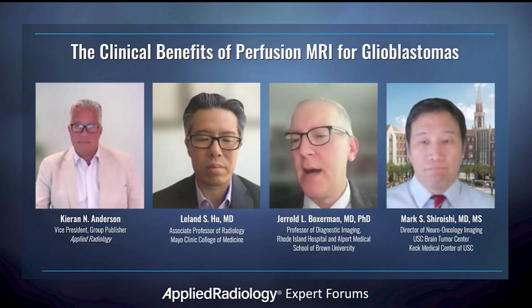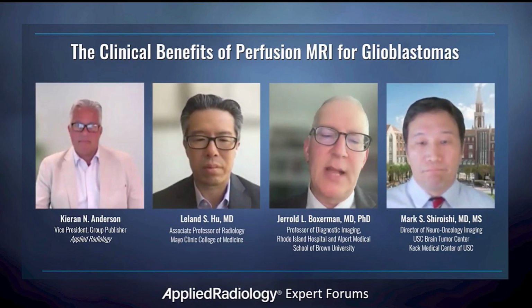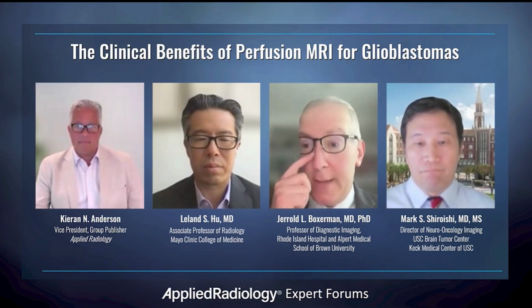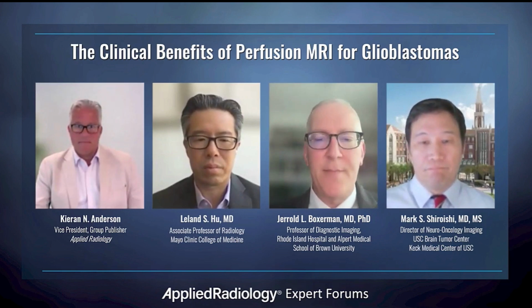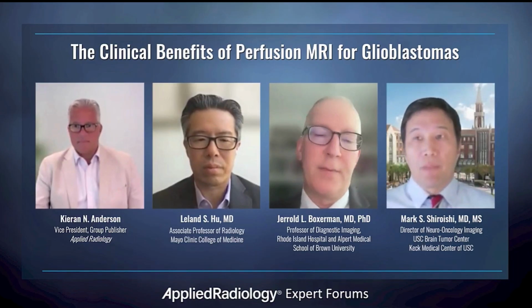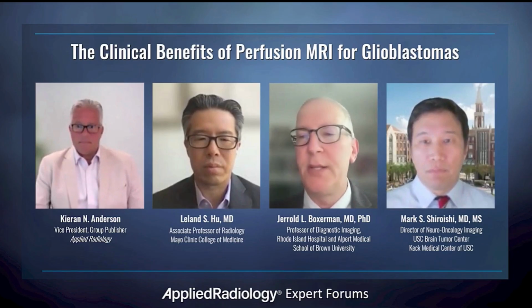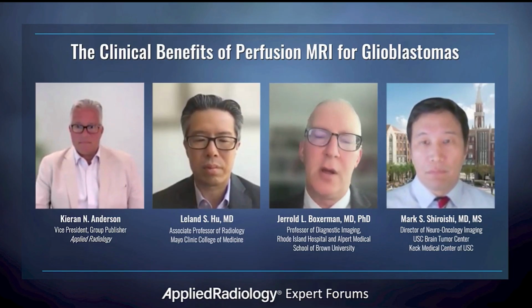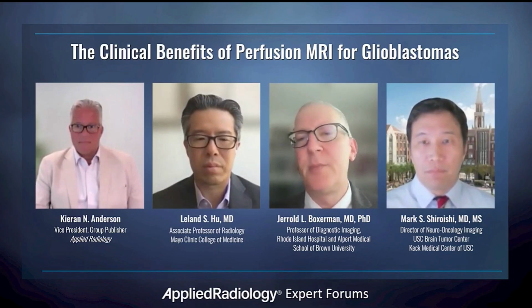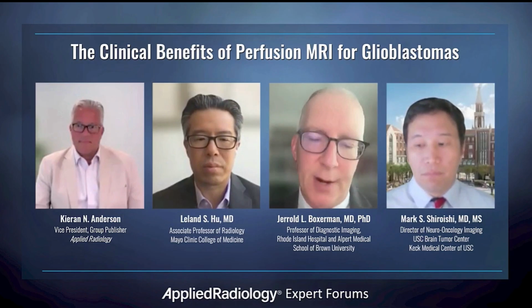I think that improved software for identifying these subtle areas of perfusion elevation that are separate from contrast enhancement, which might be a harbinger for disease progression, might help us capture early progression a little bit sooner than we do currently. So I think software development is another tool that will be helpful down the road. I think these are two of the main areas of improvement that we'll hopefully realize sooner rather than later.